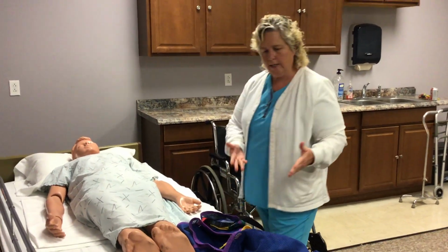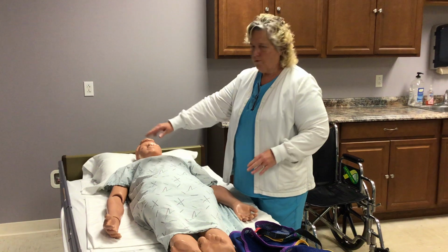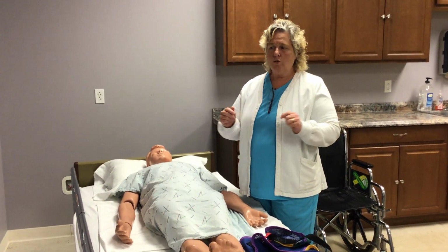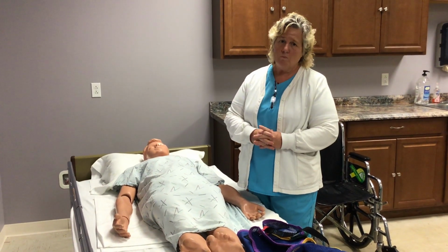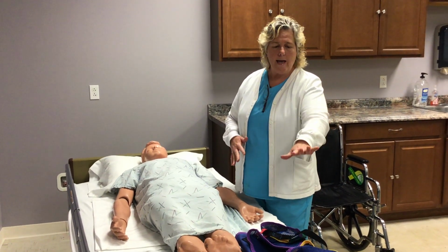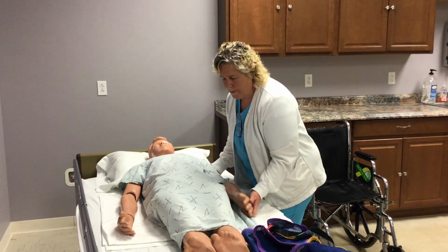So how am I going to get that sling lift underneath a person by myself? I have rails over there, but if you're in a home setting, you might not have rails and you may need to put some chairs or something safe over there. But more than likely, the person might be able to just maintain their weight on their side while you're able to get the sling under them. You're using their shoulder and their hip. Bend your knees so you won't hurt your back.